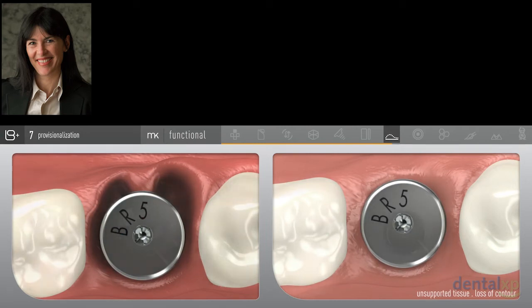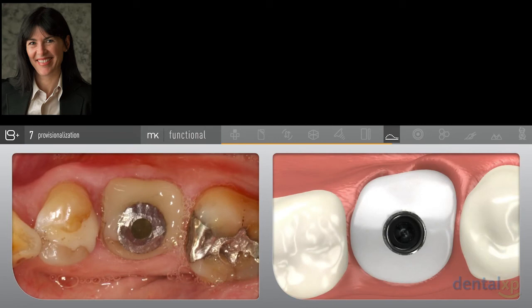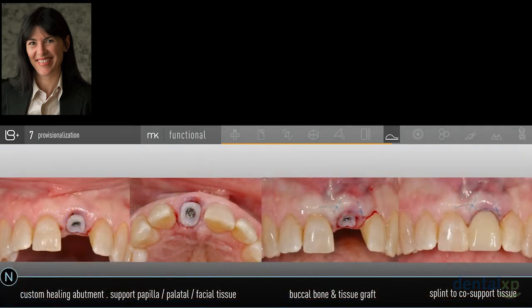Today, and I think we have a lot of great opportunities with digital technologies that are coming out, but today I'm routinely creating customized abutments. Most of the time I'm doing them at this point in my career intraorally, but I think there's all sorts of avenues that this can create. So I don't have a tooth in place, but I have the subgingival envelope scaffolded and supported. And when I looked at this, I started seeing some great treatment outcomes, and I started exploring this.